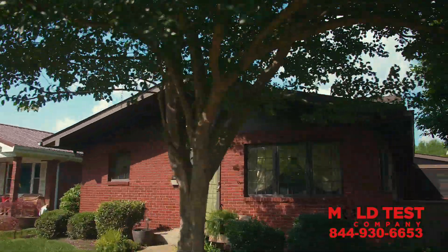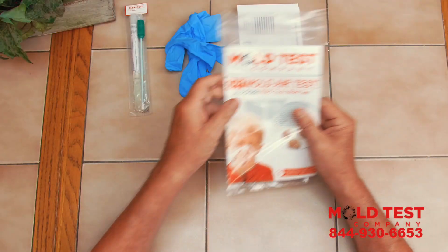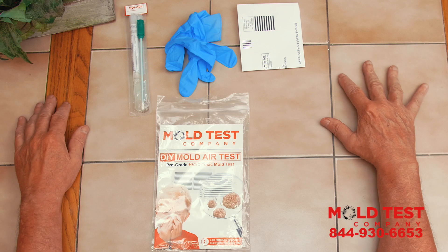Mold Test Company's DIY Mold Test Kit is fast, accurate, and easy to use. Included in your kit is one specimen bag, one sterilized testing swab with one specimen container, one glove to ensure sterile testing, and a prepaid envelope.